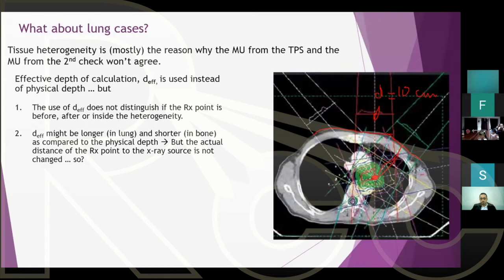Depending on where you are in lung, density of lung could go from 0.2 gram per cc to 0.35 gram per cc. Meaning it is 20% to 35% of the density of water. And if I want to take the average, let's say average, as if lung is 25% tissue and 75% air. So there's a lot of air, not much interaction.